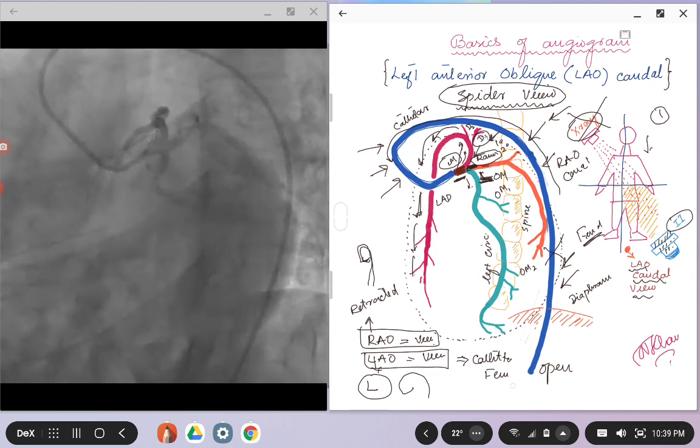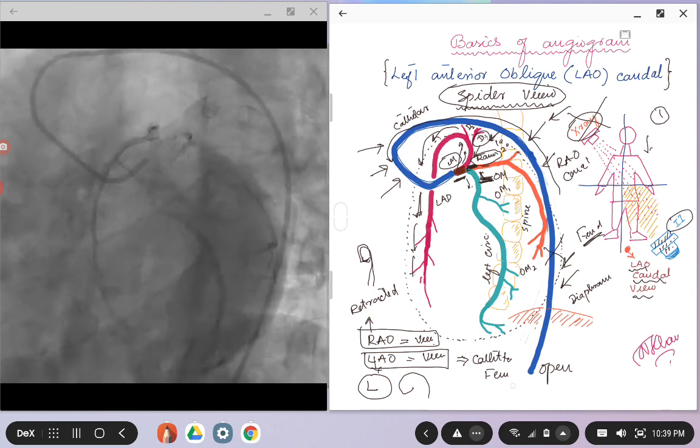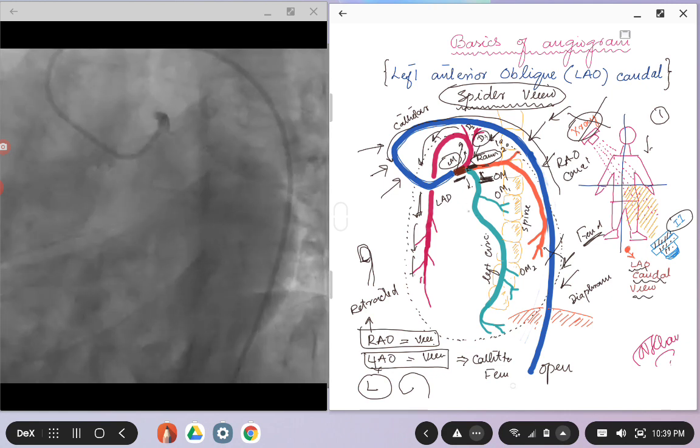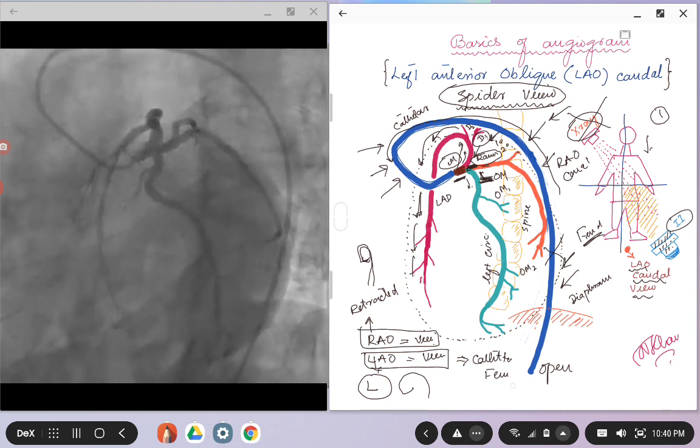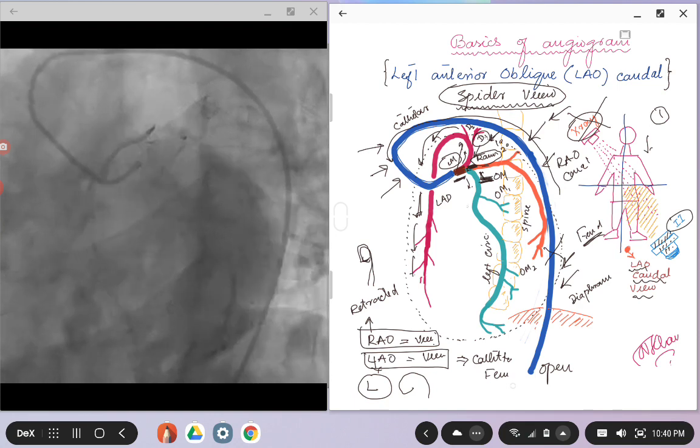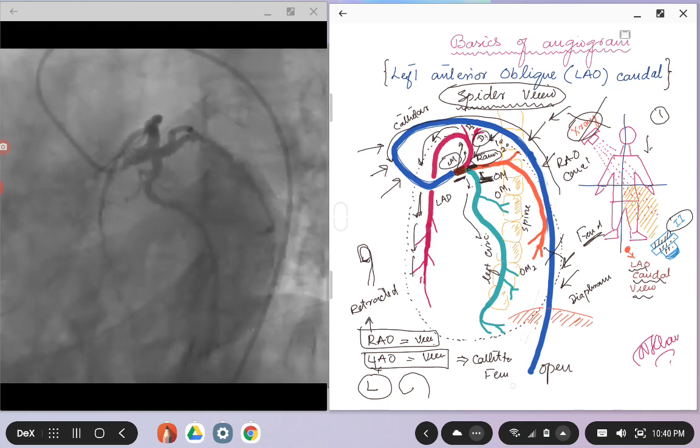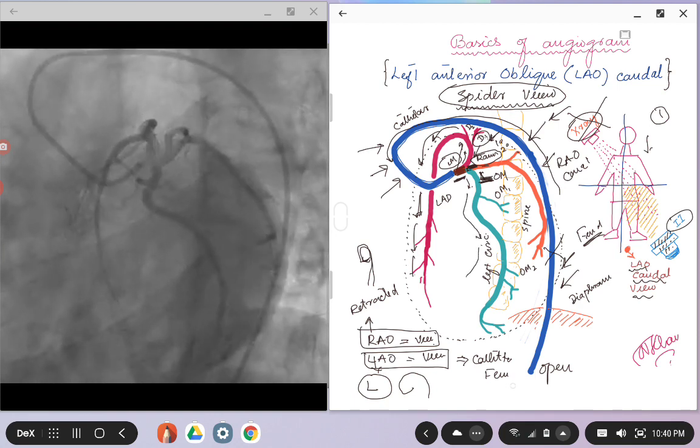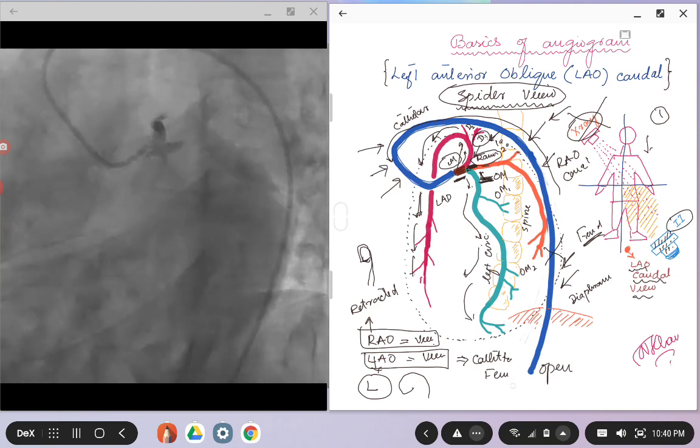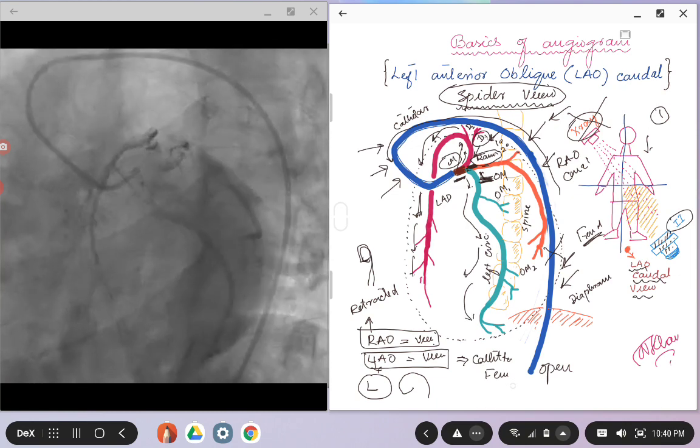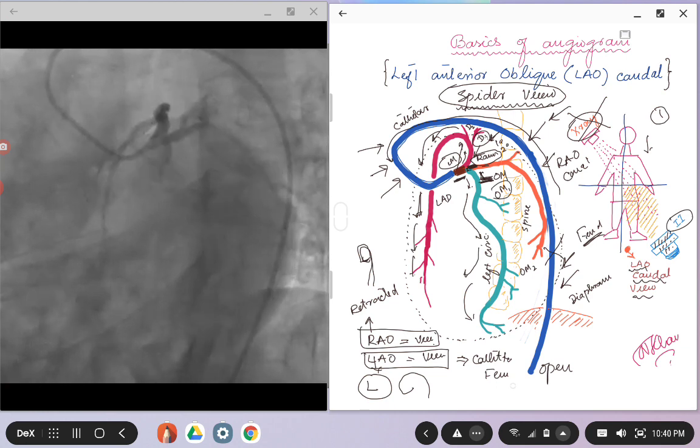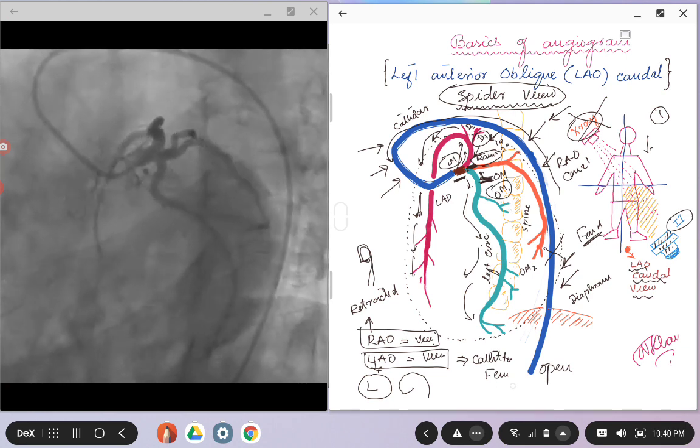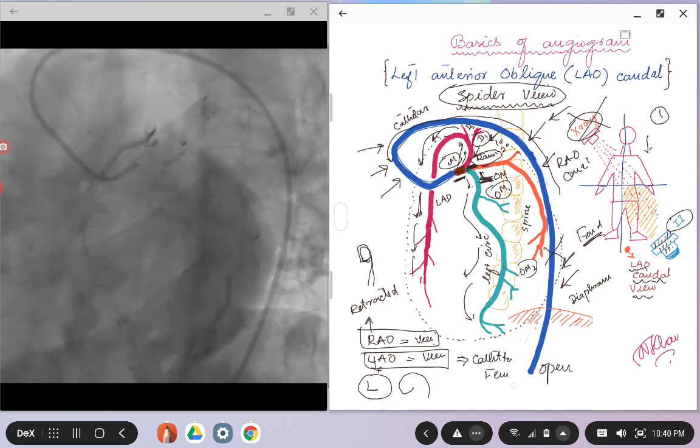And again, as we talked about, the caudal views are good for the left circumflex. That is the artery that will be mainly in the screen, nicely opened up, so here you see that left circumflex. And then the branches that the left circumflex will give, let's say in this example OM1 and then OM2.